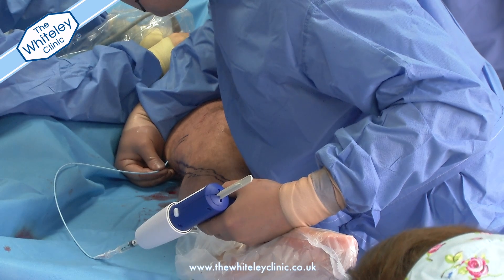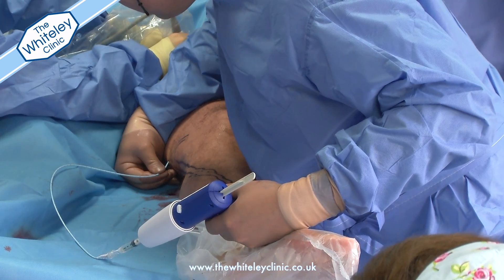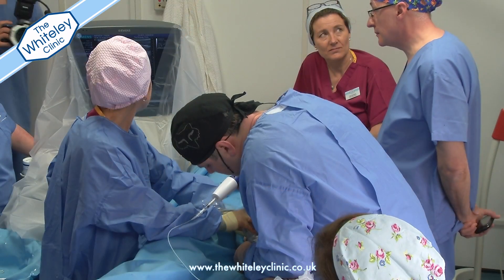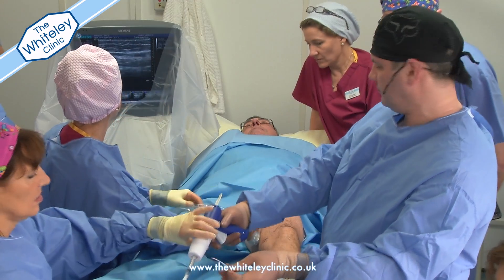Once the procedure is finished, the catheter is removed leaving just a tiny pinhole in the leg. There may be other procedures needed, particularly if there are thread veins or big lumpy varicose veins, which might need local anaesthetic, but this new glue technique treats the main vein.